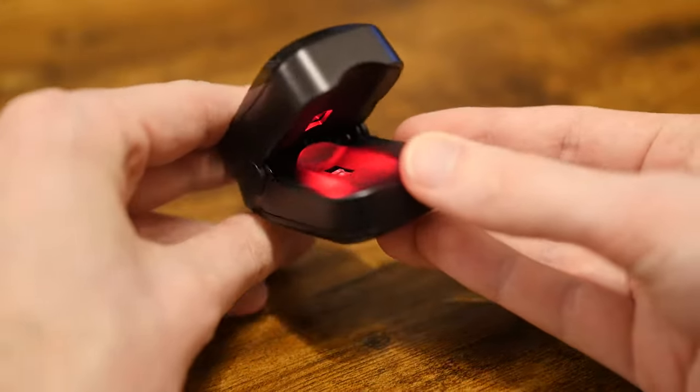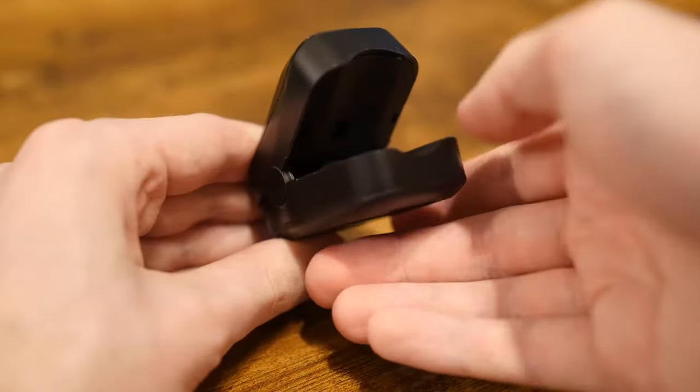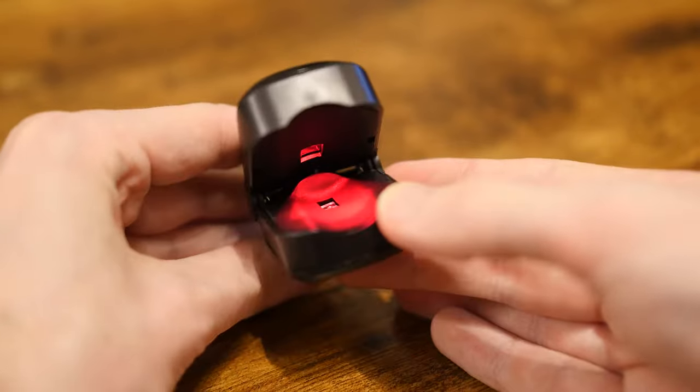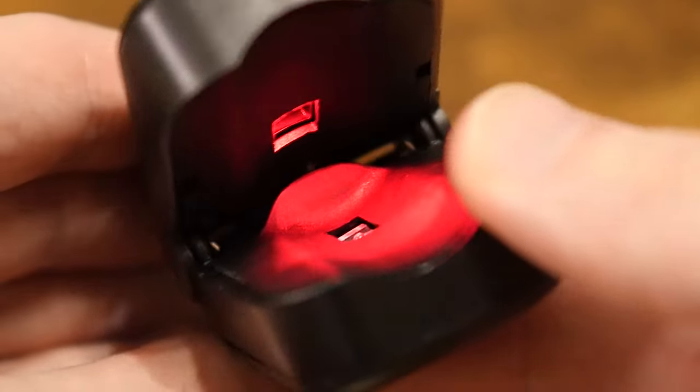It all comes down to some very clever science. Because if we actually open up my pulse oximeter here, we can see a clue as to what might be going on. You can see at the top here, there's a red light that shines downwards when I turn it on, and a sensor underneath. But what exactly is this machine looking at?